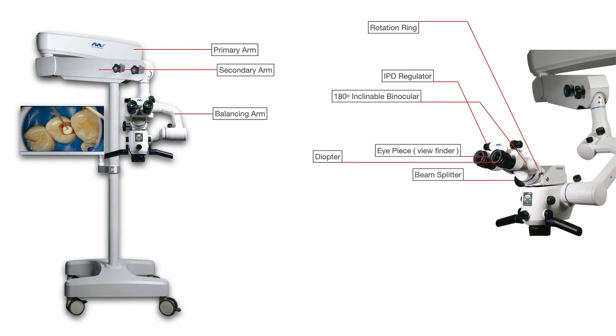Beam splitter is important for people who are using, for example, an assistant's eyepieces, or who want to use a mobile phone adapter or DSLR camera. But I believe that this kind of camera is better because it is updated, slim, and small. So I don't advise using an external camera as much as possible.